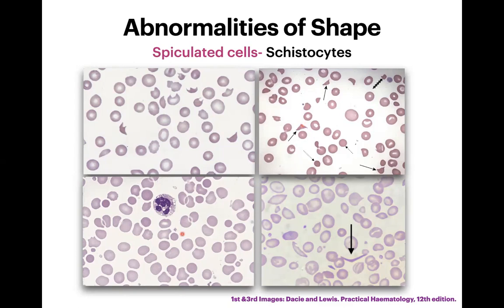Again, here you are seeing these microspherocytes. You can see the sizes and shapes are variable, and the size is pretty small. These are microspherocytes from a case of burn. And this is the other special type of schistocyte I talked about, the linear fragment. In sickle cell anemia, you will find this kind of schistocyte. So this is a schistocyte, not a sickle cell. I'll be showing the sickle cell image in the next few slides.